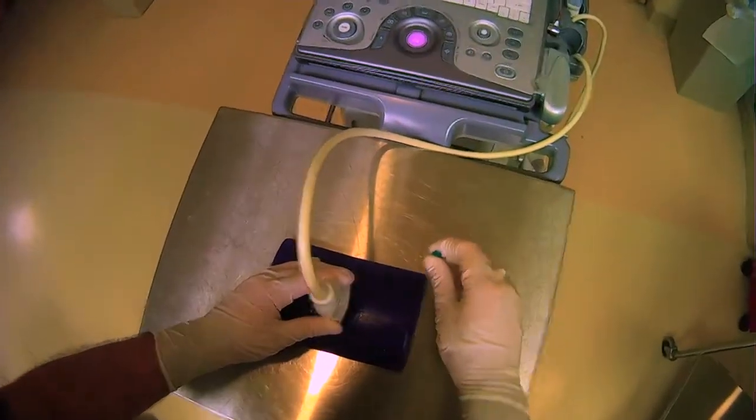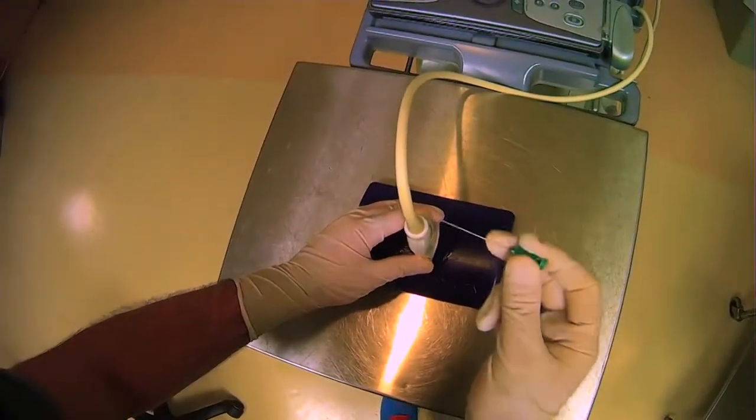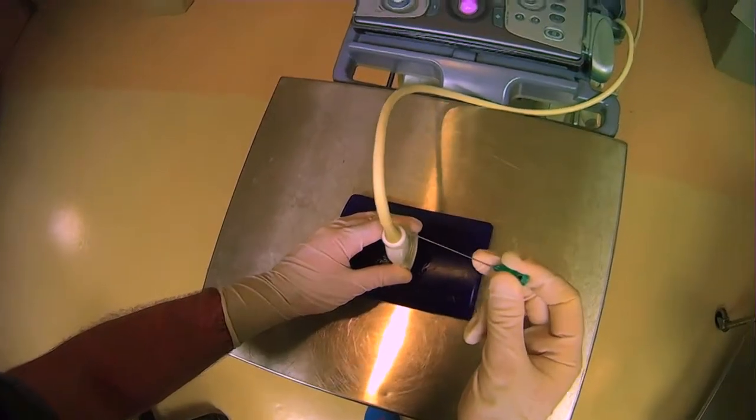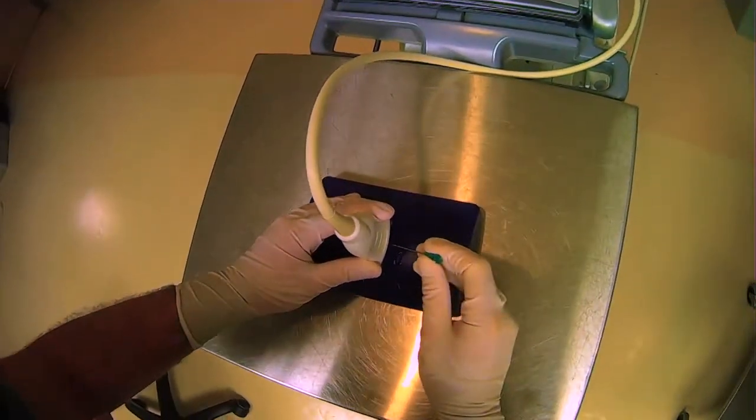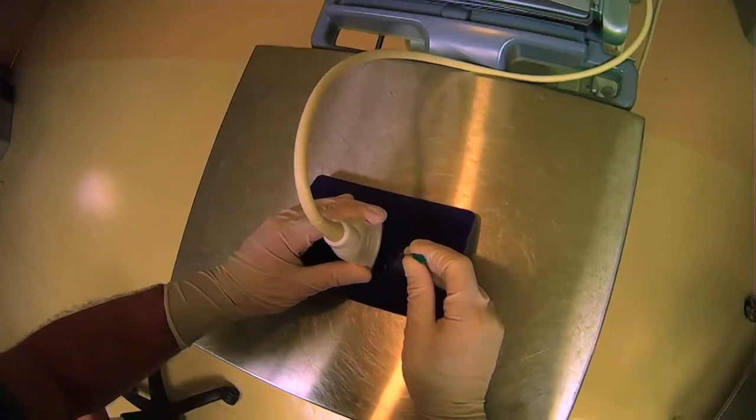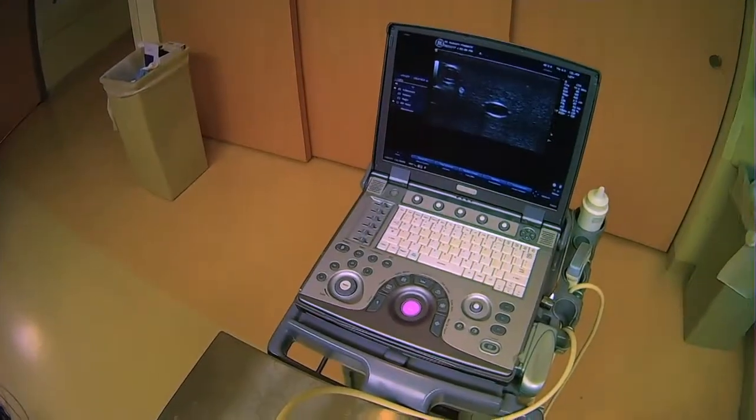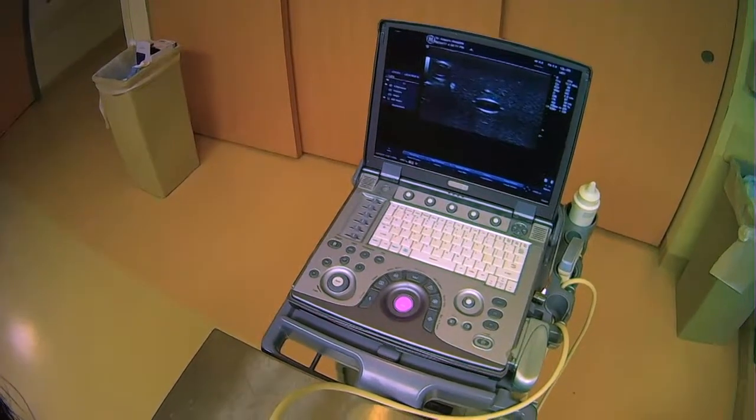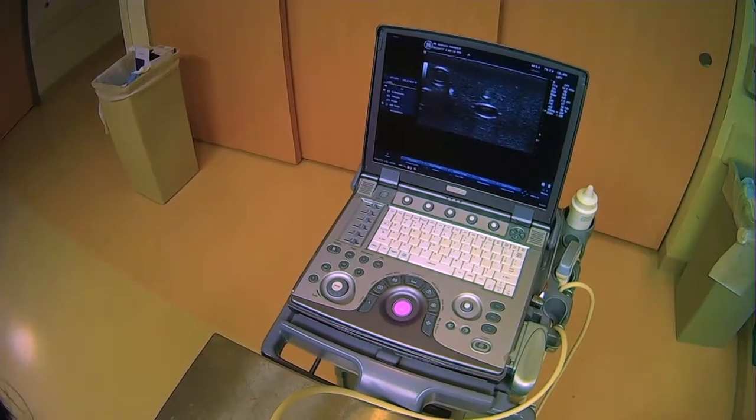So obviously you can keep the probe like this facing right up and you can insert in the middle of the probe like we discussed here and you can look on the screen when you see the needle tip.